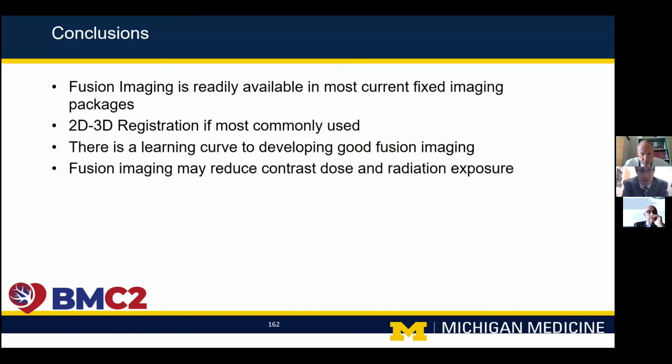Then you move on to doing it for your more complex cases and really trusting your ability to do this, and fusion imaging has remarkably decreased our contrast usage. So I think the learning curve is actually pretty short. The other part of it is that you can practice making your images as much as you want, just sitting at a computer. So I think that makes it another part that's pretty approachable.